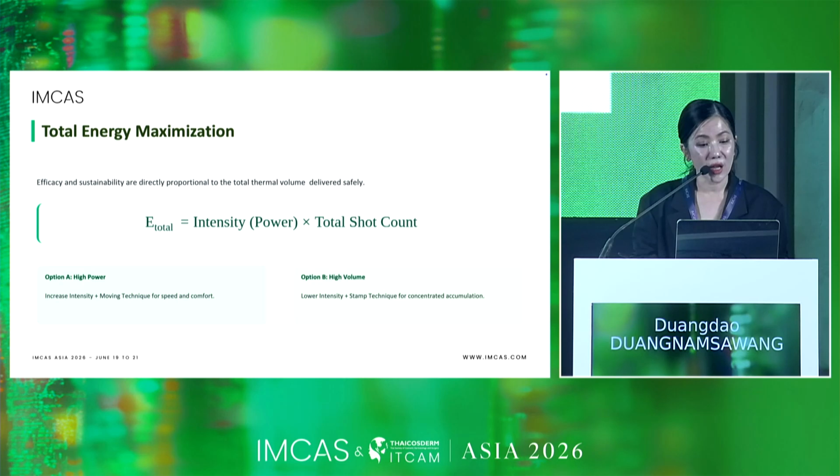Another point is how to maximize the energy. There are 2 options. Option 1 is to use high power. Option 2 is to use high volume. If you have limited shots, you can raise the intensity. But if you have unlimited shots, you can increase the total shot count.